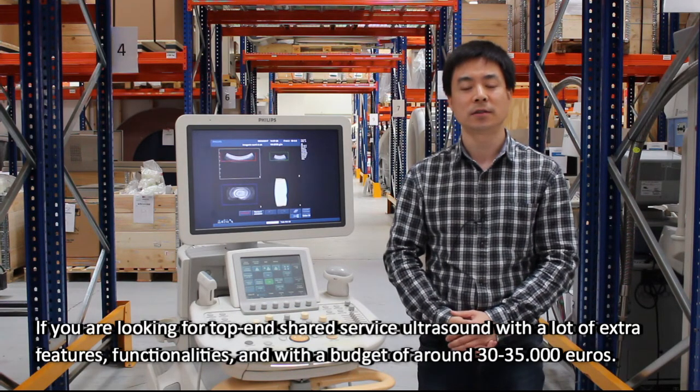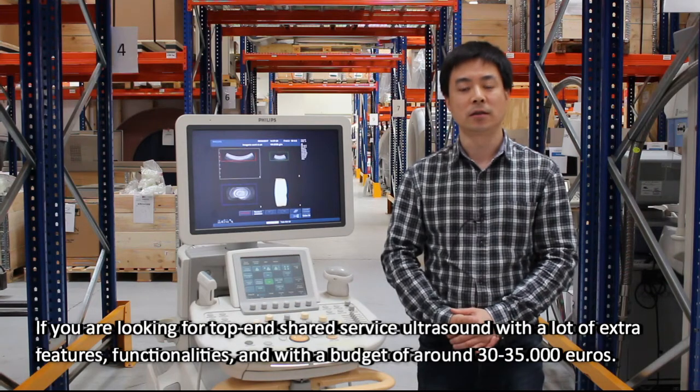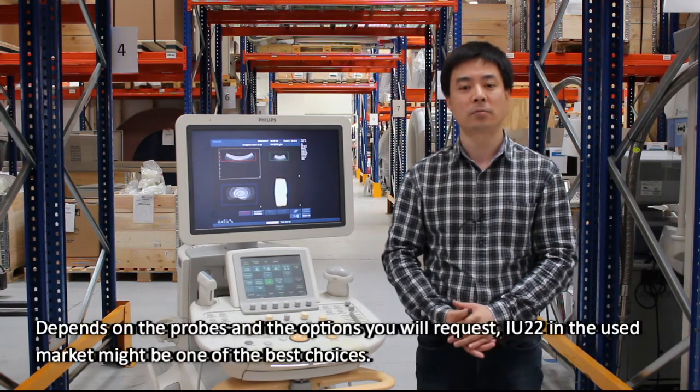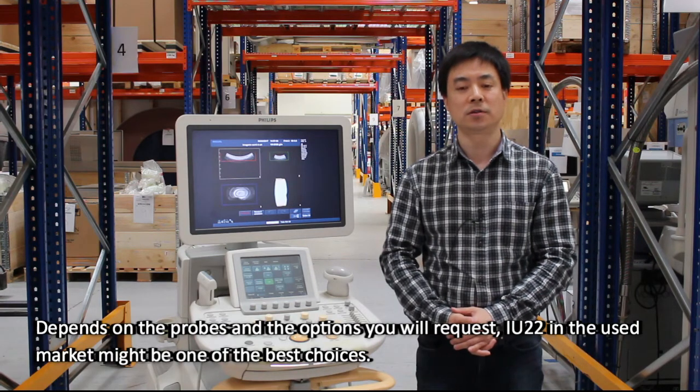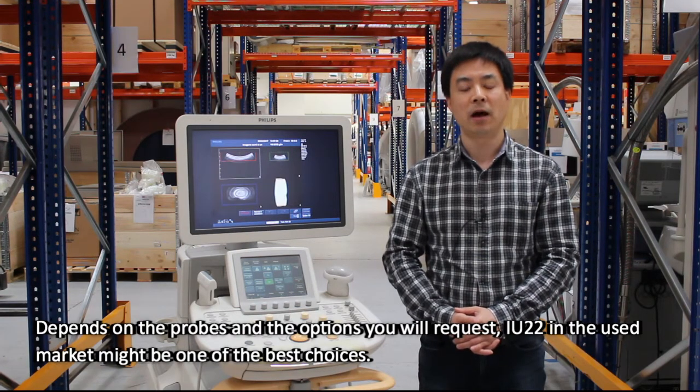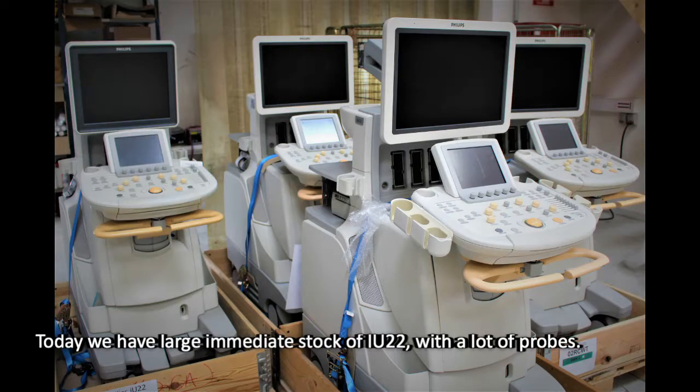If you are looking for a top-end shared service ultrasound with a lot of extra features and functionalities, and with a budget around 30,000 or 35,000 euro depending on the probes and options you request, the IU22 in the used market might be one of the best choices. Today we have a large immediate stock IU22 with a lot of probes.